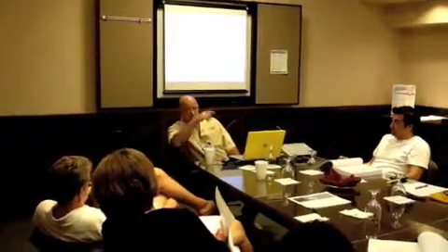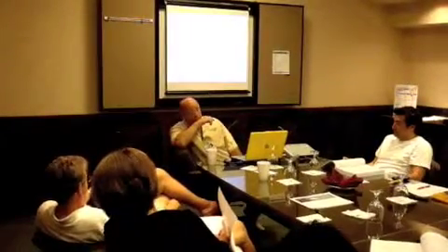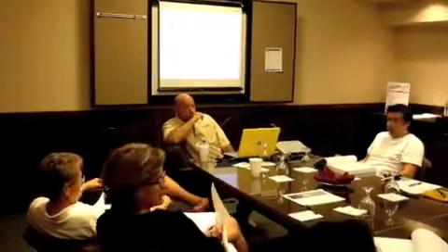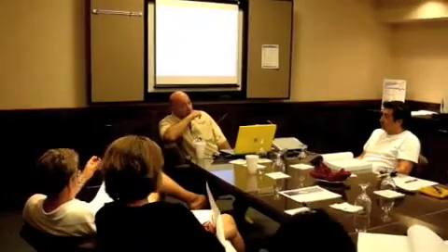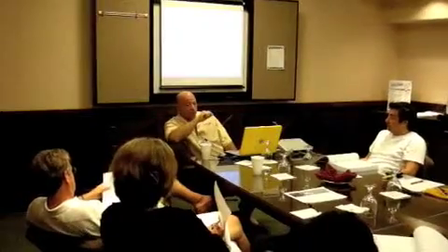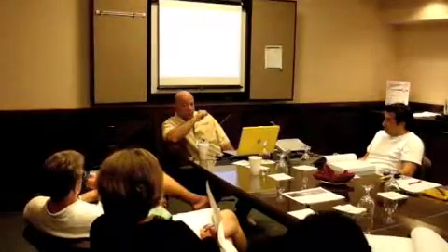SIMV gives you 10 breaths a minute and you can breathe 20 breaths, 20 tiny ones in between. What happens if you're at AC and you breathe 20 times a minute? It gives you 20 full breaths, full tidal volume. So just patient effort triggers a full breath with AC. But in SIMV, the patient can just breathe whatever they want in between, unless you have pressure support. What's pressure support? Then you trigger it.